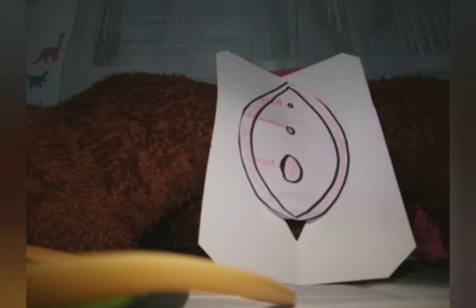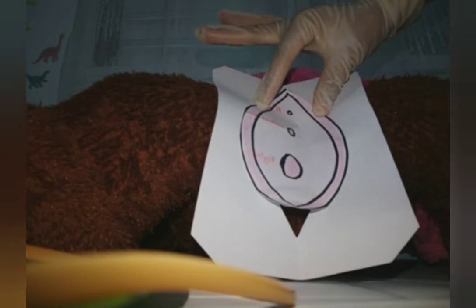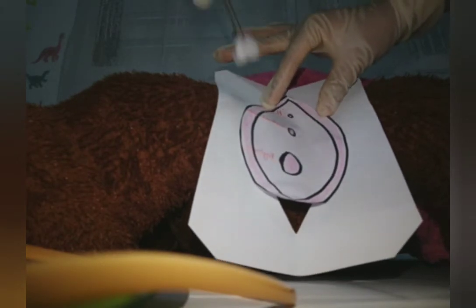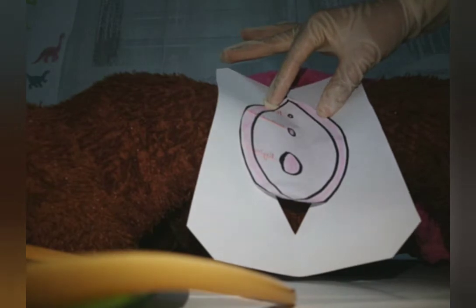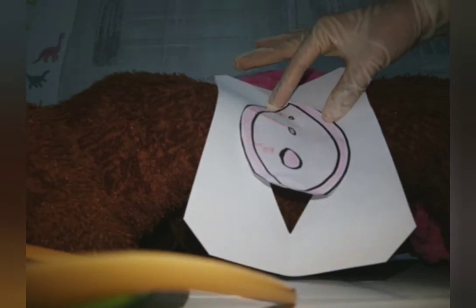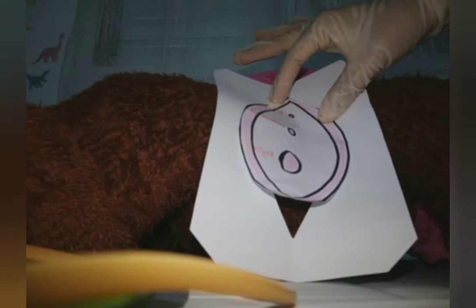Now with my non-dominant hand, that is my left hand, I will identify the meatus by retracting the labia and hold this position until I finish the procedure. So with my dominant hand, I will apply the antiseptic to the farthest side from top to bottom and discard. And now the nearest side from top to bottom, and in between from top to bottom, and I will let the antiseptic dry.